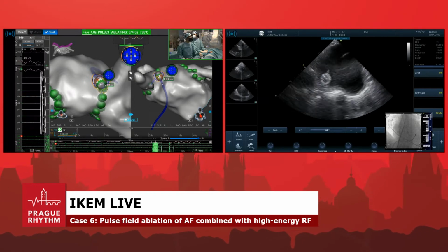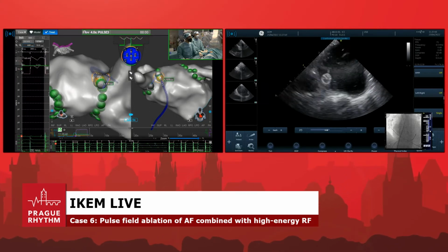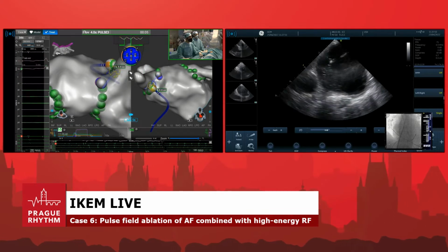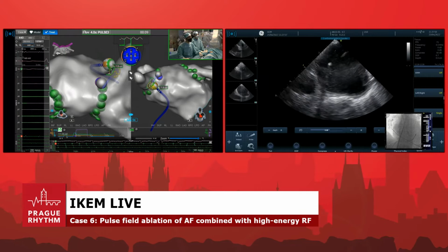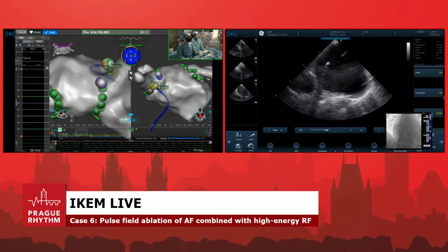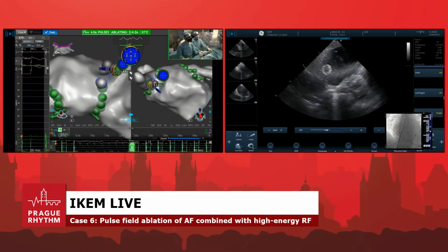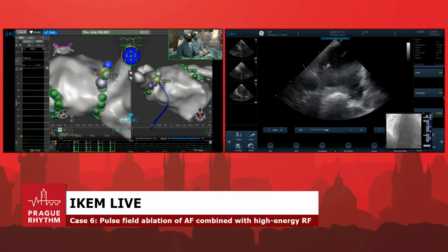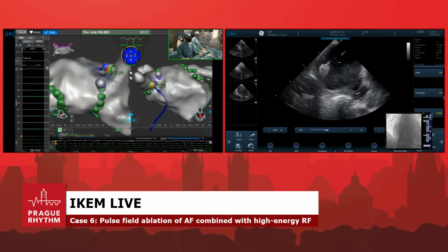Okay, so I see that you are close to finishing the circle between the applications. We are going to finish the circle now. I think we have a couple more lesions here. And then we can try to evaluate what really happened there. And it will continue with a box lesion, yes? Yeah. Okay, do you have any questions?